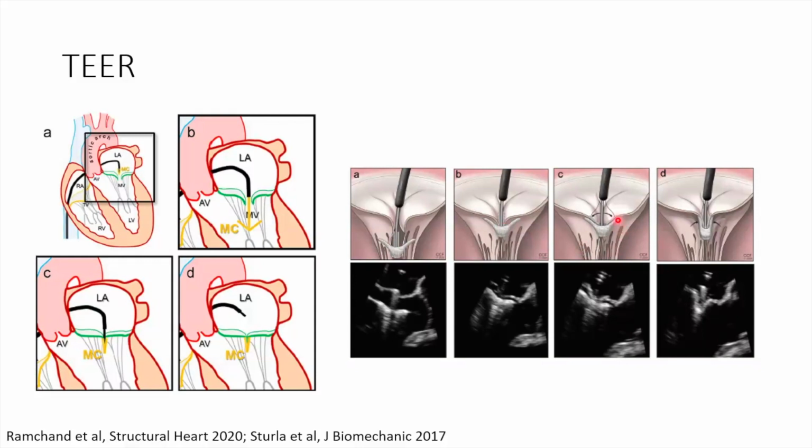The arms, you want to make sure at this point that the leaflets are inserted into the arms. What the arrows here are showing is that these grippers, which actually have frictional elements and hooks on them, are then closed sequentially, or, in these newer generation clips where you can have independent grasping mechanisms, sequentially closed and positioned.